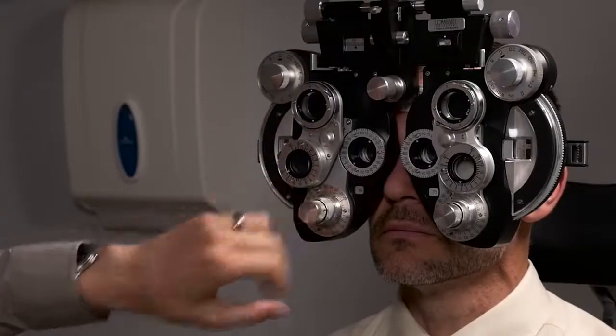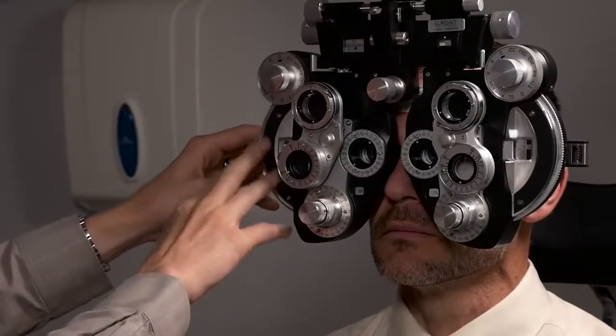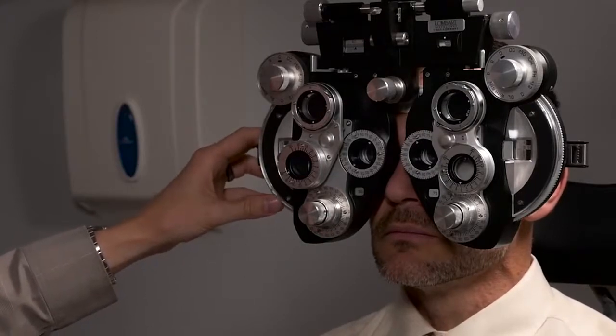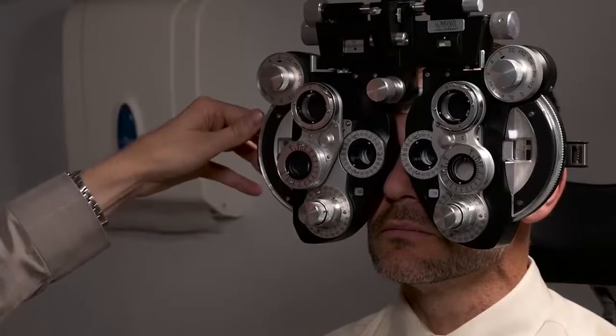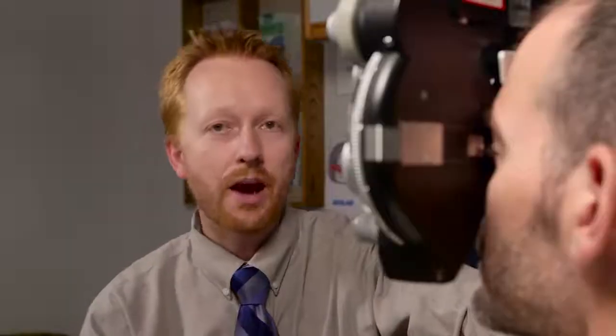I go back to the spherical component and refine it a little bit more, asking a few more questions: 'What looks more sharp and clear, number one or number two?' — Two, then one. There are other means by which you can make sure you haven't over-minused or over-plussed the patient — you can balance the eyes, which we can cover in a different segment. Based on his previous findings, last glasses prescription, and autorefractor results, we know we're very close. The patient reads the 20-30 line — O-F-L-C-T — and even the 20-20 line — T-Z-V-E-C-L. Excellent.